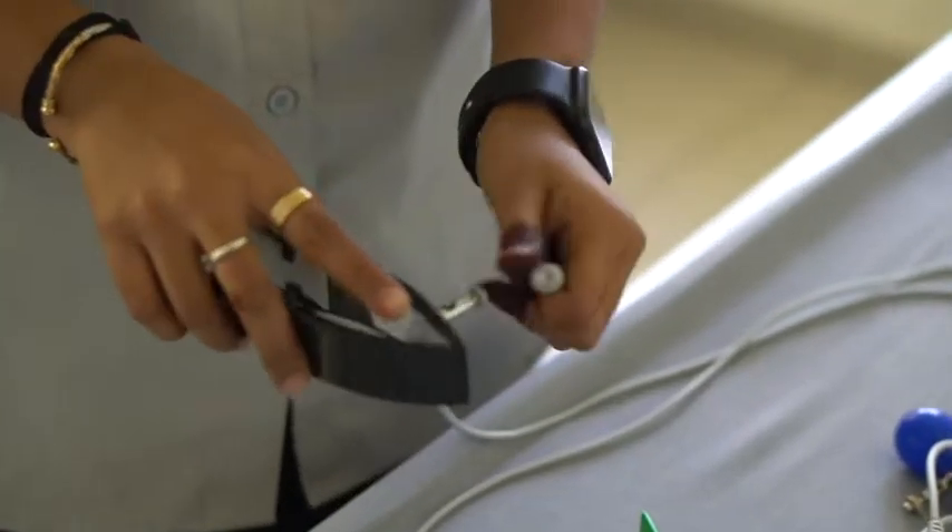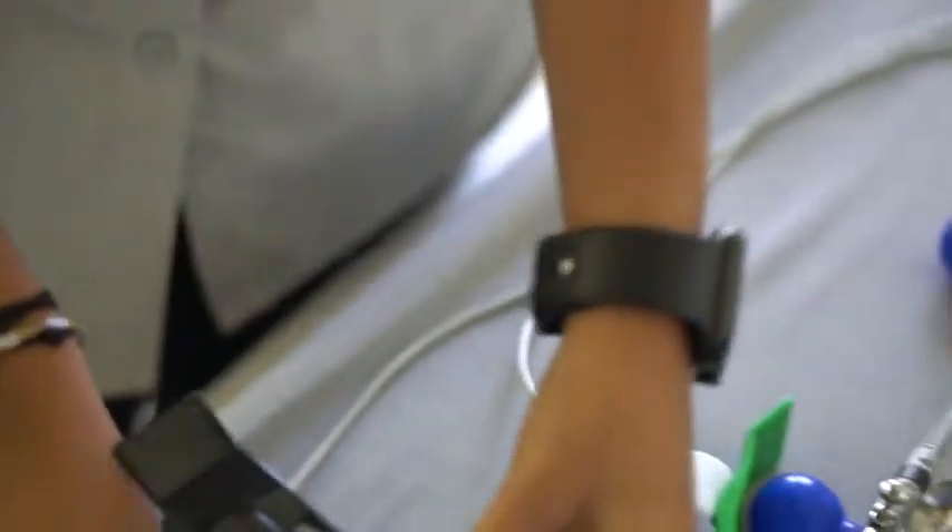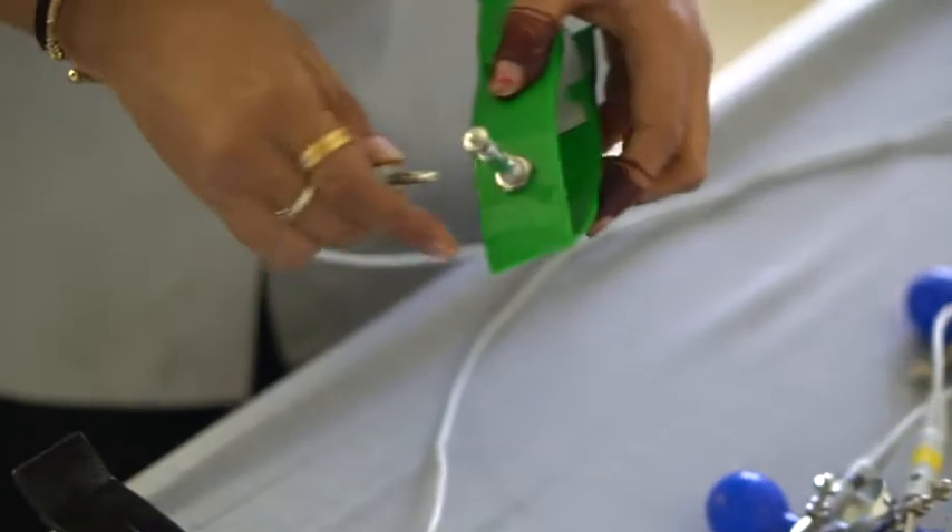Next, attach the 4 ECG clamps to the corresponding limb leads. You can simply match the color of the remaining wires to the color of the clamps.